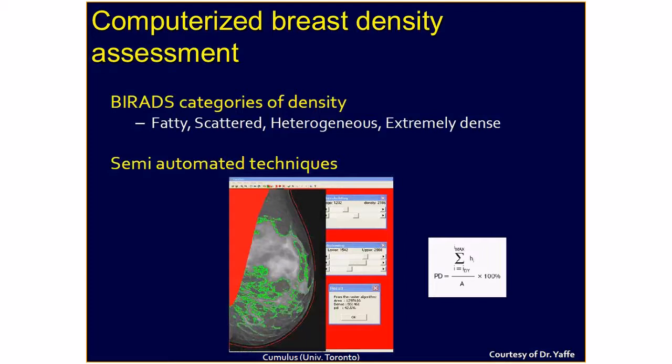Yes. So there's commercial software that does this visual analysis. The people that developed that software actually have patients that were imaged with mammography and then with MR. So they have 3D tissue volumes. They do the measurement and calculation on that, and compare it to the MR. So there's sort of an indirect validation of that software. But basically, most often, whatever the radiologist reads is going to be the same.